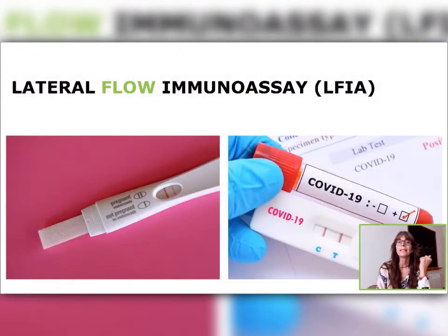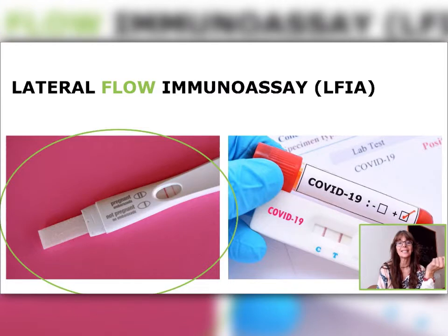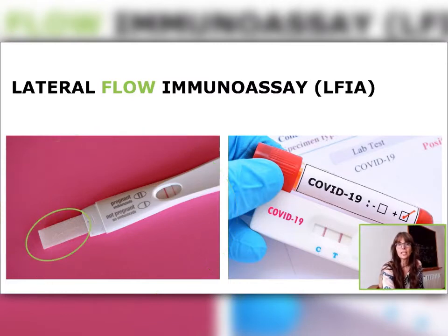I'm sure many of you know the classical home pregnancy test. This rapid test, as the COVID-19, is a lateral flow immunoassay. It is very easy to use. This end of the device is introduced in the biological fluid sample, and 10 minutes later we have one red line if the test is negative and 2 lines if we are pregnant. Now we need to put magnetic particles in these lines. Let me tell you what for.